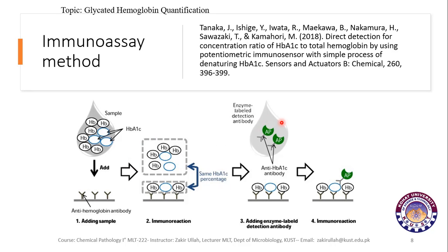This is the reaction of the immunoassay method, in which there is a well having anti-hemoglobin antibody, and the whole blood sample is added to this well, and there is an immunoreaction in which the antibodies to the hemoglobin attach.